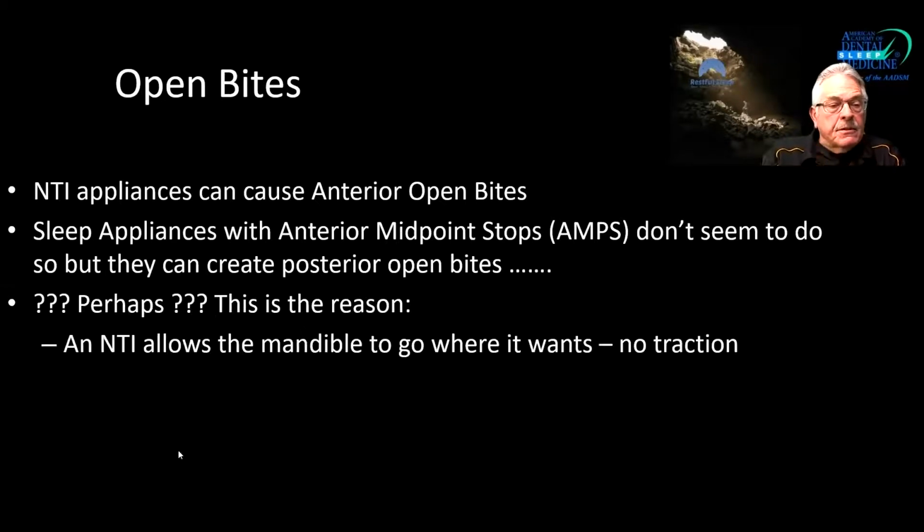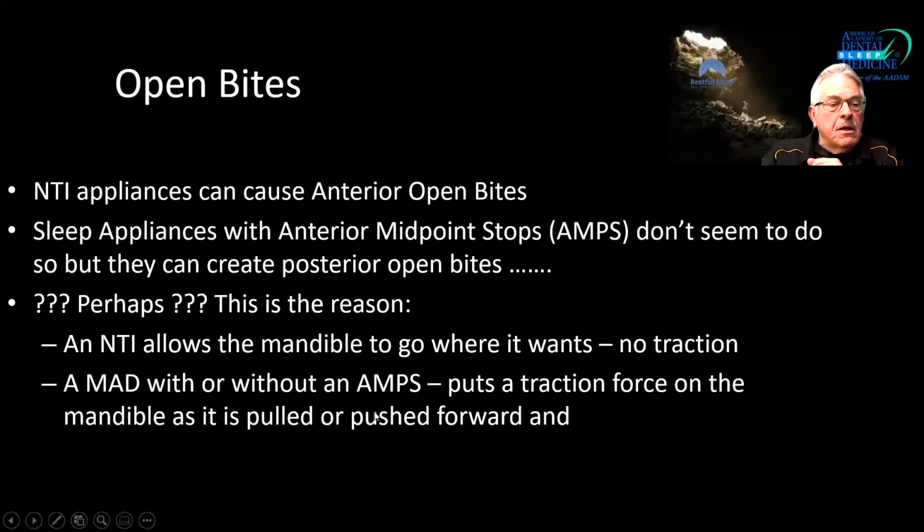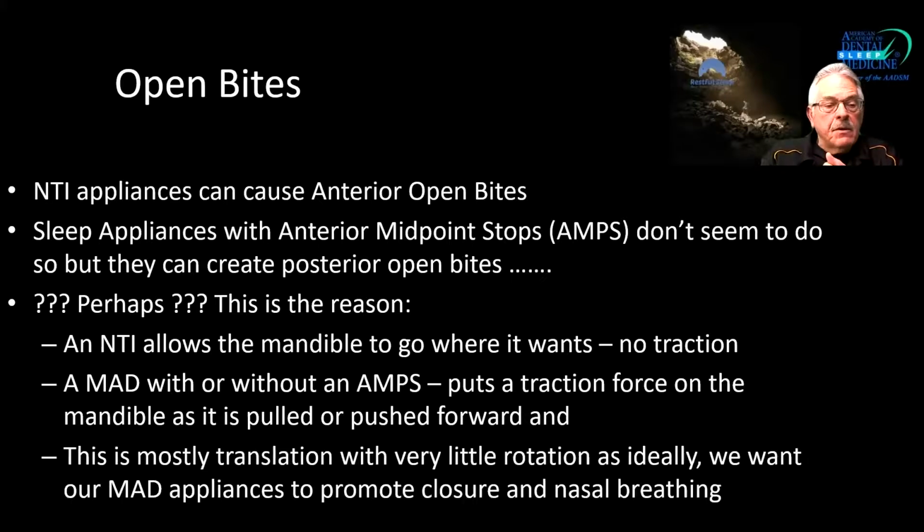Here is perhaps the reason. An NTI allows the mandible to go wherever it wants. There's no traction. We're not trying to pull the mandible forward. We're not holding it forward. A mandibular advancement device, with or without an anterior midpoint stop, puts a traction force on the mandible as it is pulled or pushed, depending on the appliance, forward.